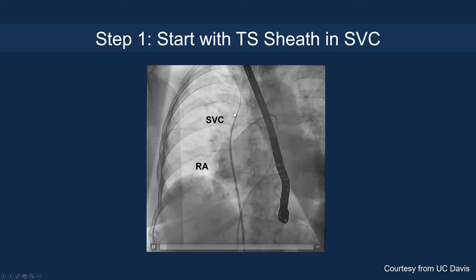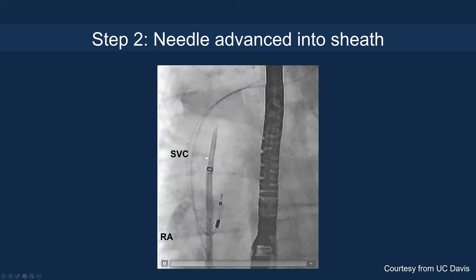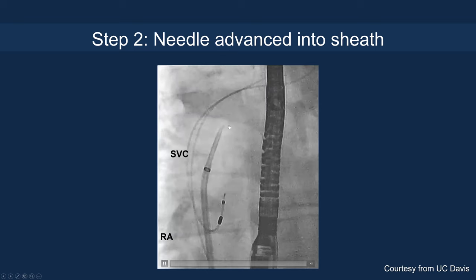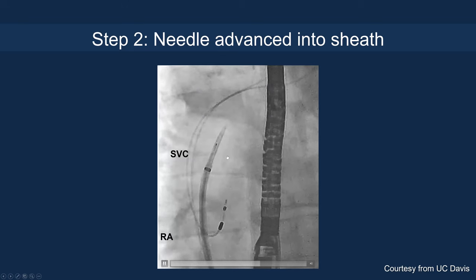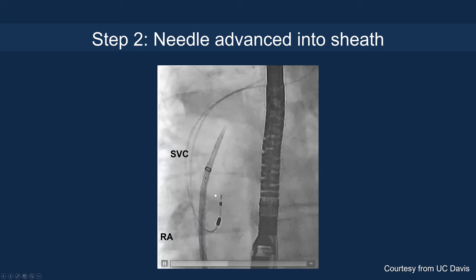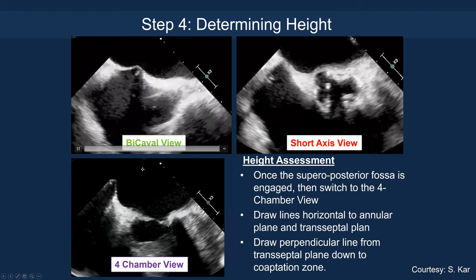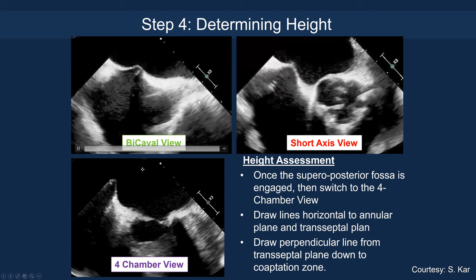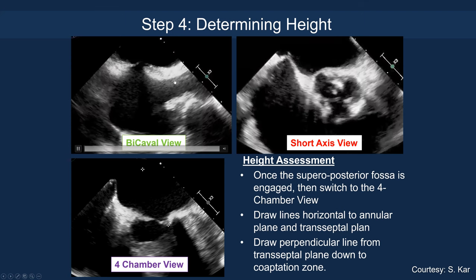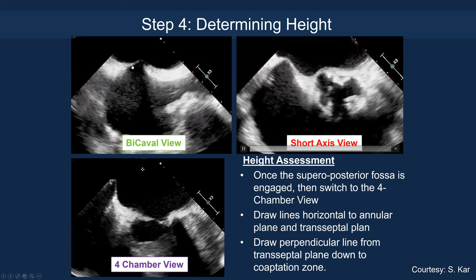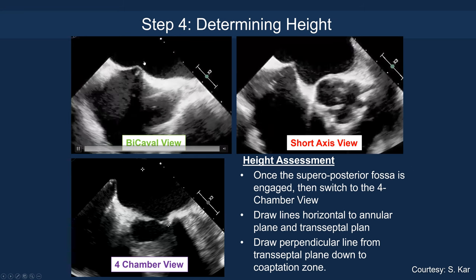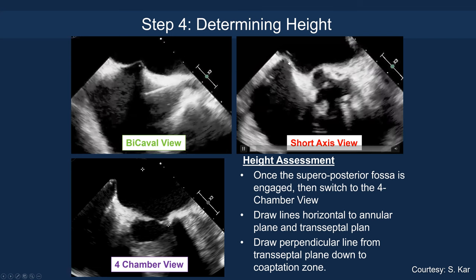This shows the transeptal puncture site with the transeptal sheath in the SVC using a 0.032 floppy wire. You advance the needle — do not expose the needle tip outside the sheath to avoid injury, as this provides more support to the sheath. You then come down to the fossa ovalis and you can see the drop, which tells you that you've landed on the interatrial septum. You confirm this on the bicaval view, essentially going along the reverse aortic root axis, and you see the tenting on the mid and posterior septum.